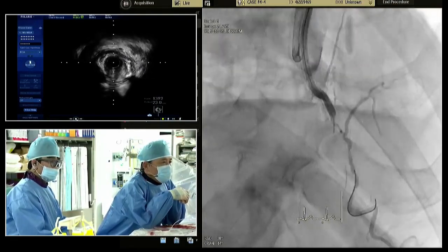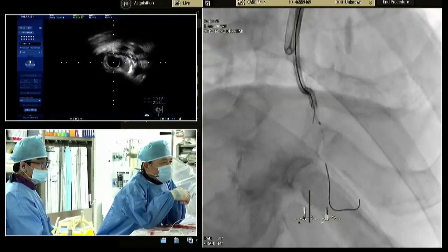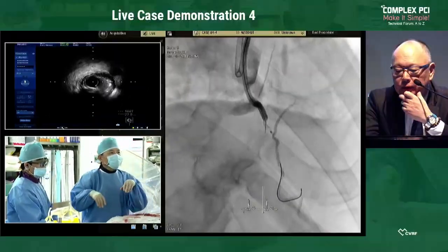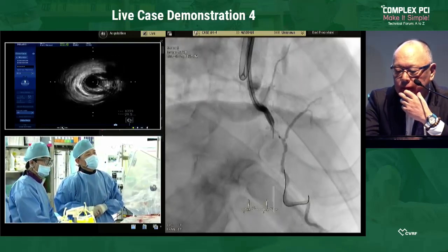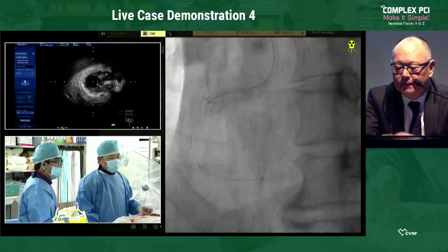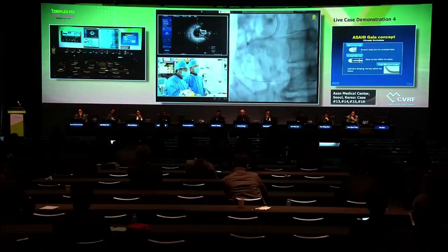Thank you. Will you protect the artery branch before stenting? Maybe. I was finding it shows some flow disturbance of the artery ostium, because I will check the angiography from now. Okay. Because of time, we're going to go to the other rooms, Dr. Maoto. We'll come back to you after you have stented this and show us the result. Okay, thank you so much.